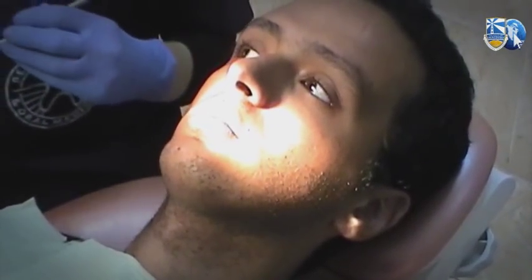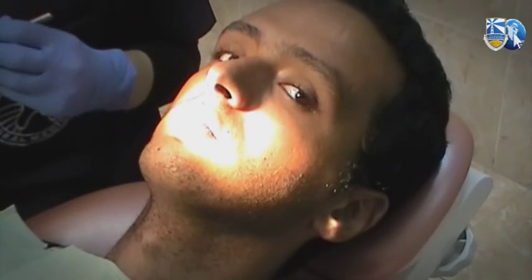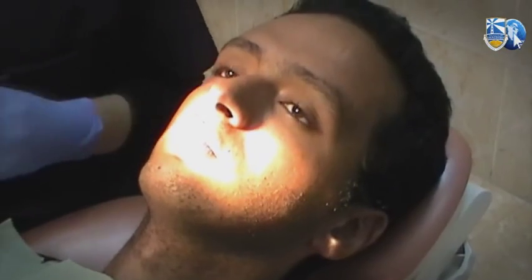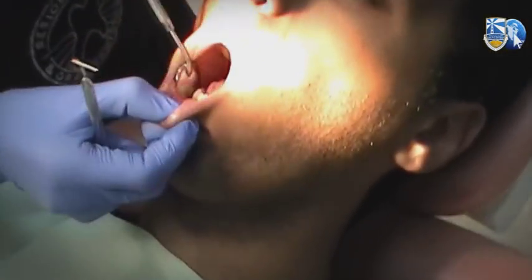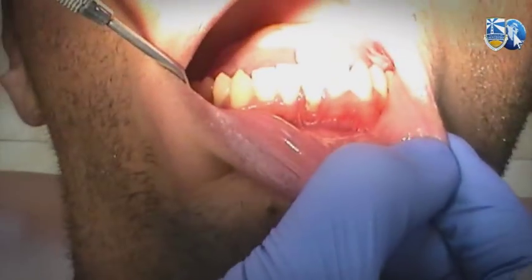I have to describe whether this change is marginal, papillary, or diffuse, and whether it is localized or generalized. This change here is located, or confined, to the marginal gingiva. So it is a marginal redness. We don't have a change in color in the rest of the oral cavity, and therefore it is a localized marginal redness. This is how I describe the color change in the patient — here it is a localized marginal redness.